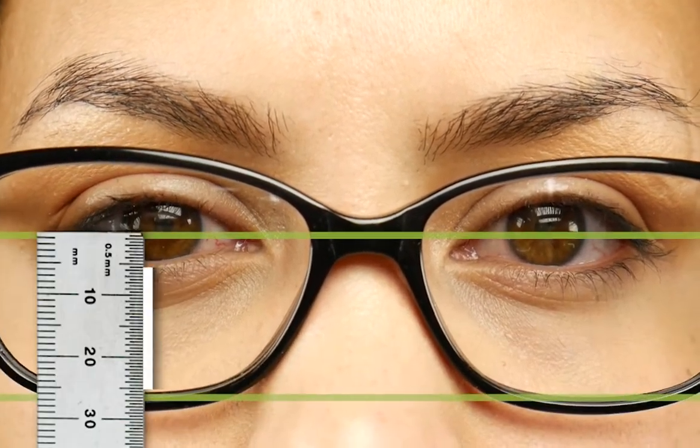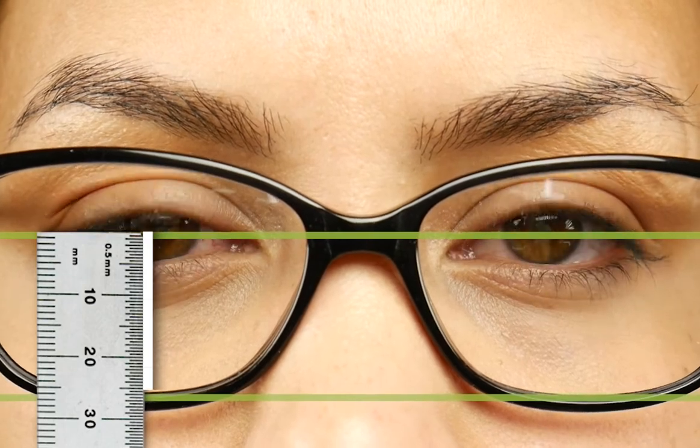In order to measure it, you're going to need a ruler in millimeters and then measure from the bottom of the lens to the center of your pupil. When you take your measurements, I would advise you to look straight ahead and to do it two or three times to get accurate measurements.